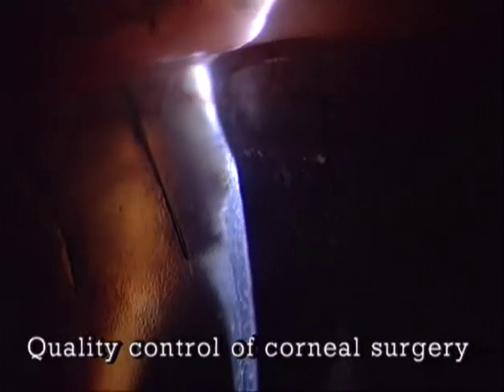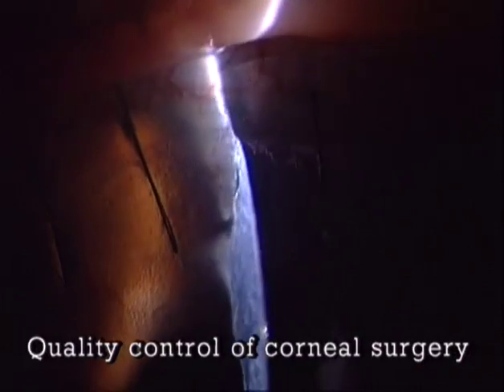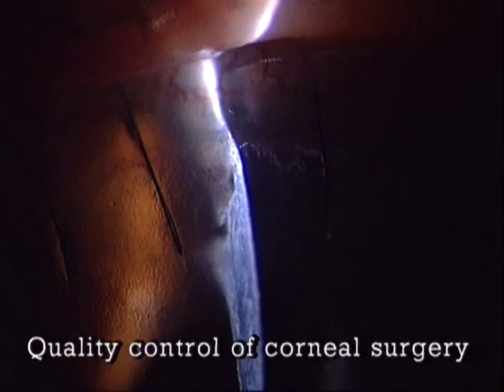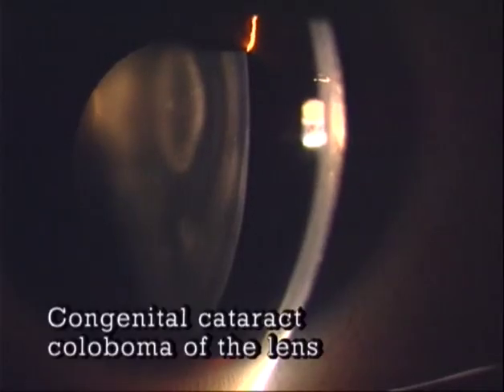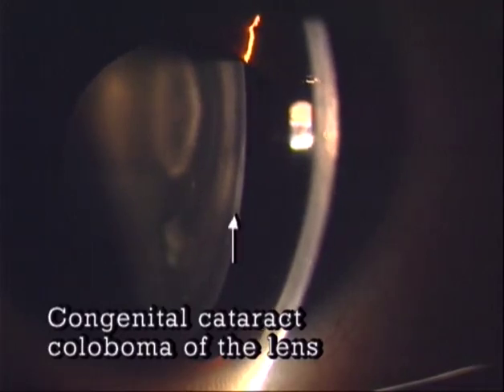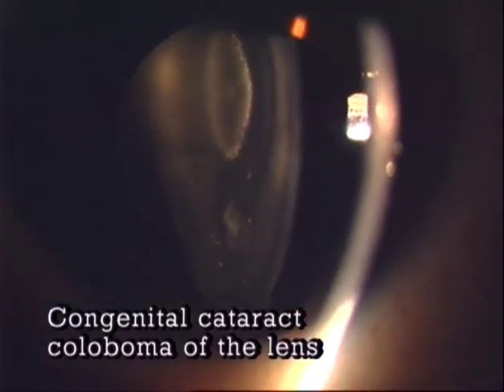In this corneal incision, the optical section through the margins reveals signs of imprecise coaptation, such as irregularities of the outer wound contour, gaps between the wound lips, and a gaping of the inner wound. In the lens, as shown here by the example of a congenital cataract and coloboma of the lens, the optical section reveals, in the cortex, the general lamellar pattern, and in the nucleus, white dots in a zone of disturbed growth during the prenatal stage.